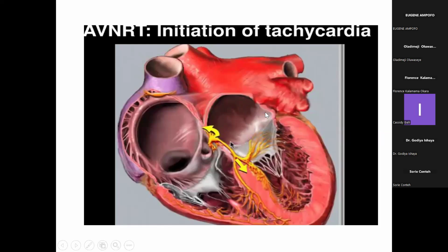So I'm trying to emphasize that when we are ablating, you either ablate to completely eliminate the tract, or ablate to damage the tract so that no activity can pass through it anymore. So those are evidence of a successful ablation.